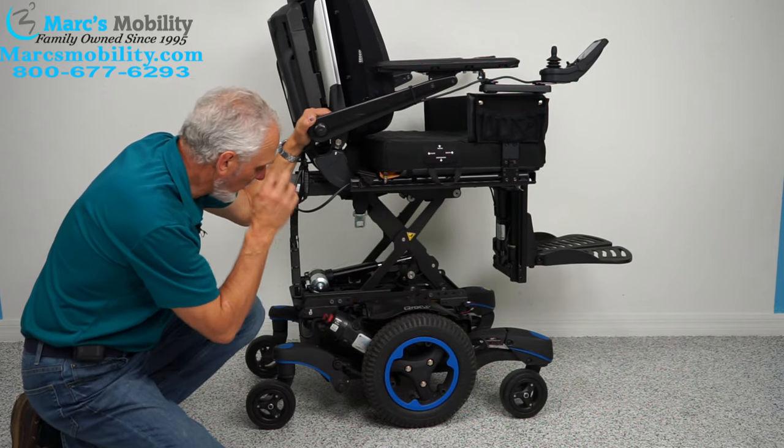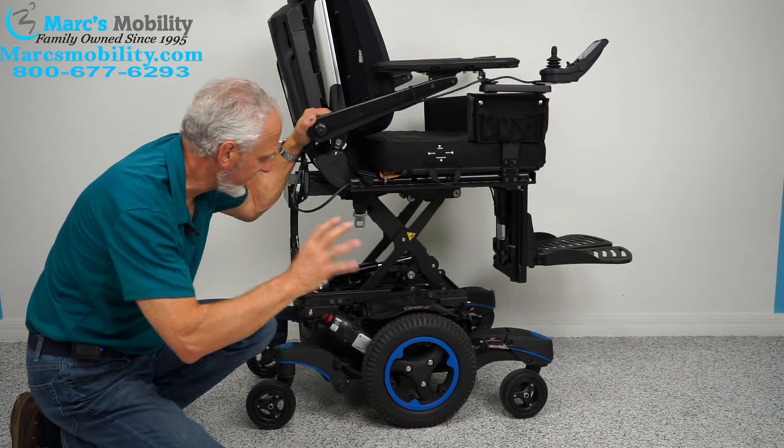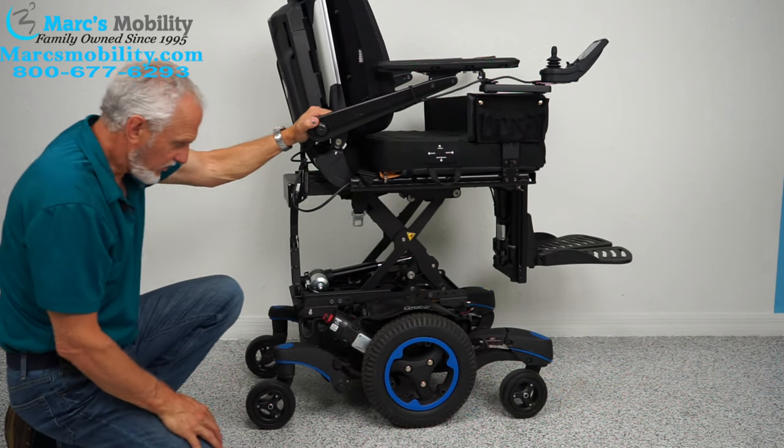These are four-pole motors, meaning there are four brushes — these are high-quality motors. The chair should also go pretty fast outside, and I'll tell you the top speed when we do the outdoor portion of the video.